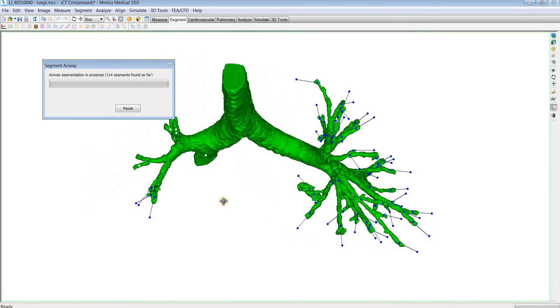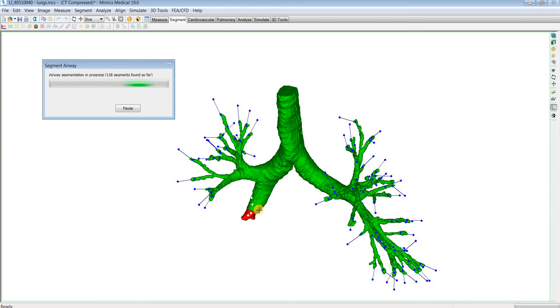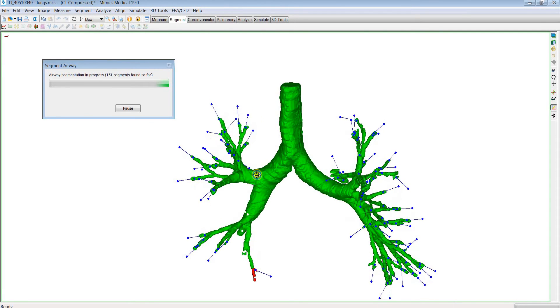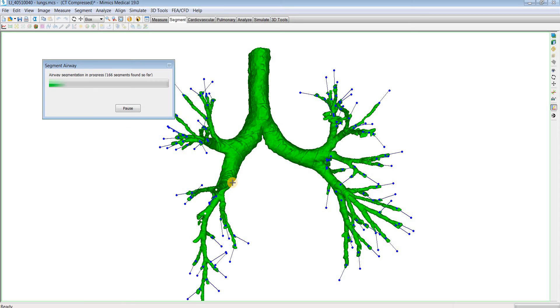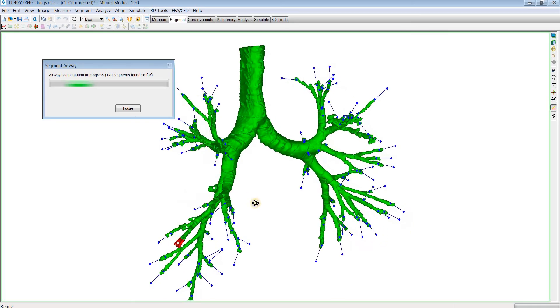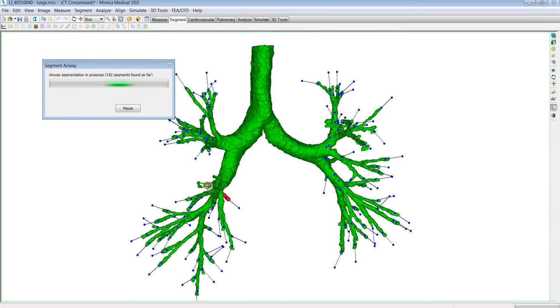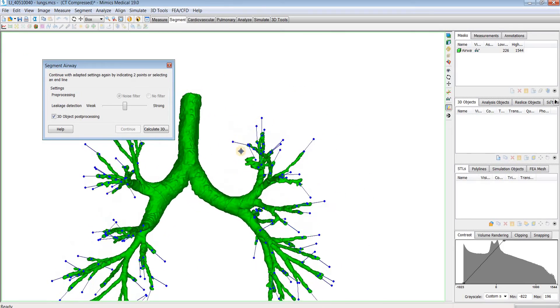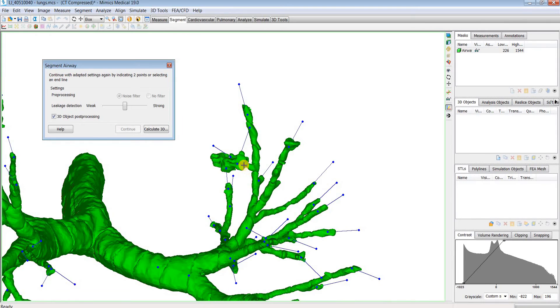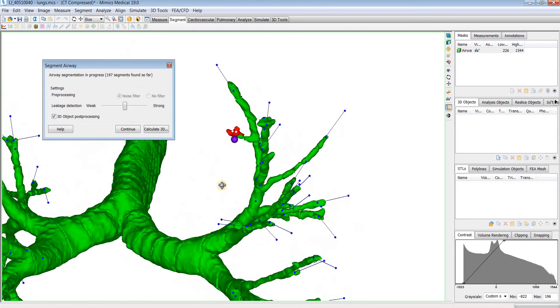It looks like we just have this one leakage on the left side. It looks like we just have that one leakage, so I'll show you how to fix it. In order to fix that, you can just left-click on that area, then right-click and place a leakage marker there. That's going to block it off and resegment that area.